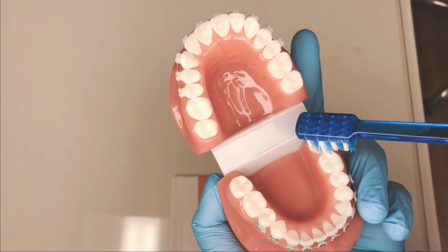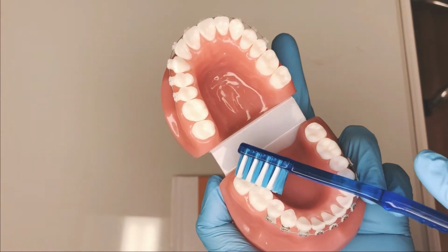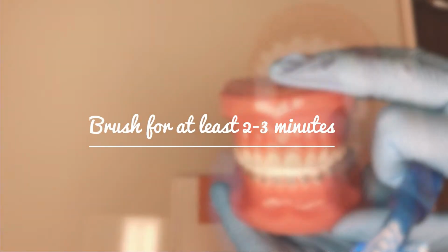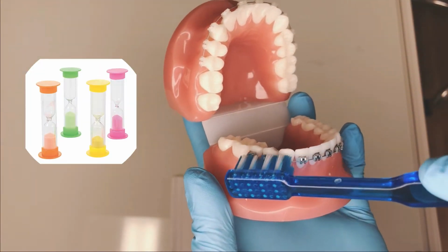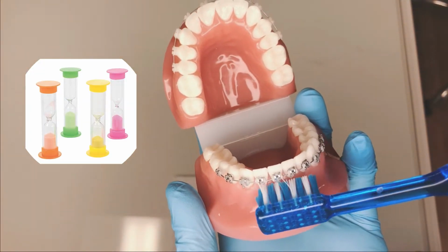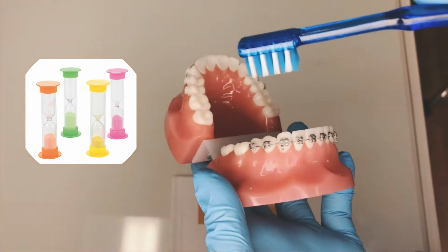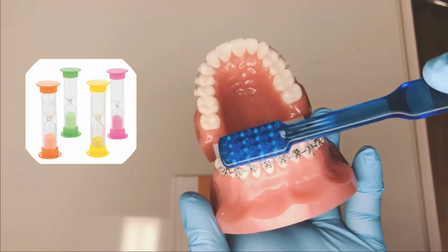Don't forget to brush the biting surface and the tongue side of your teeth as well. If done correctly, you should be brushing your teeth for at least 2 to 3 minutes each time. You can check with the timer we've included in your kit. If you finish brushing before the timer runs out, please go back to the area between your braces and your gums again.